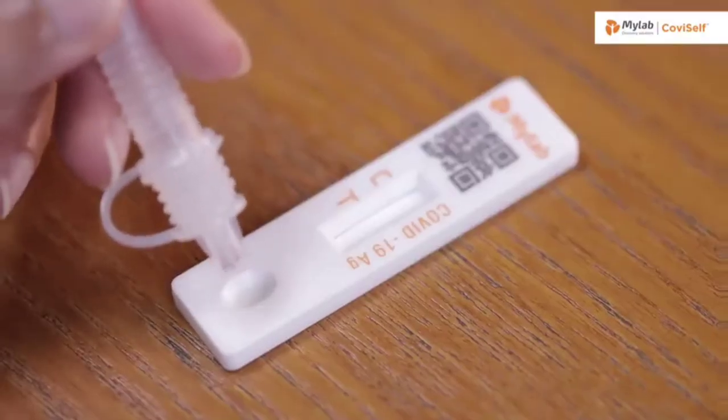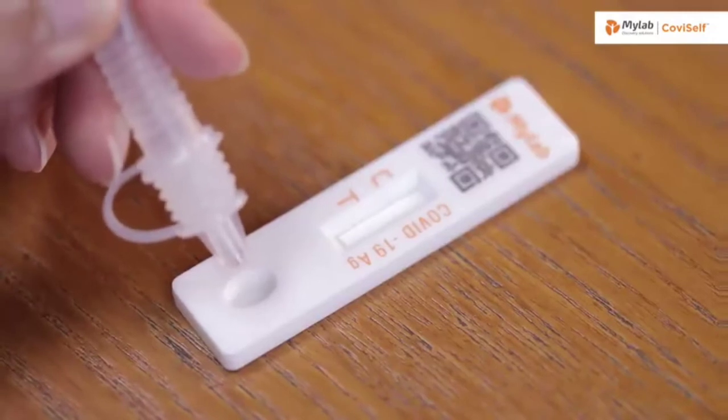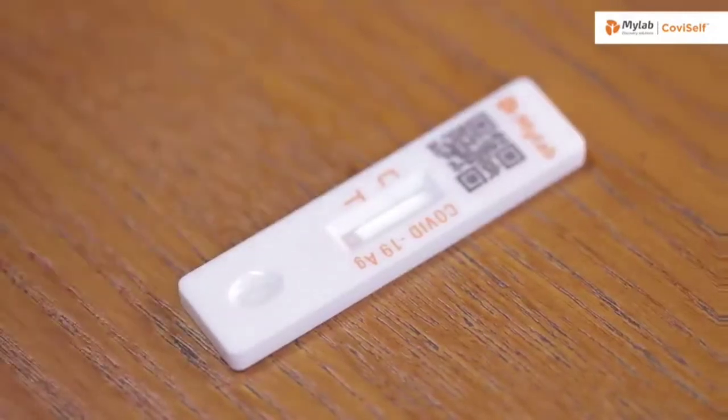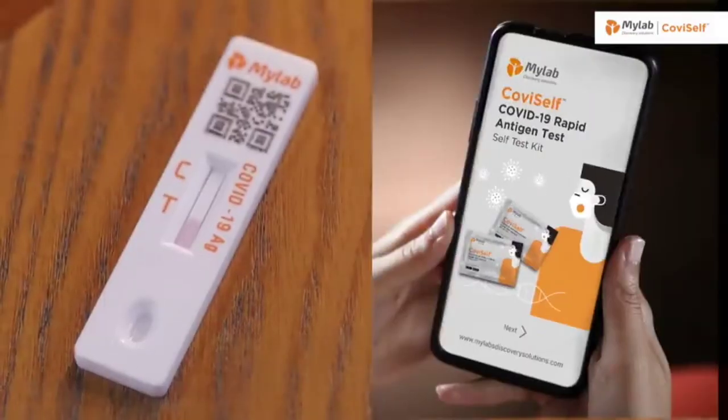Take the test card and add two full drops into the well by pressing the tube. Wait for 15 minutes for the results to appear. Any results appearing after 20 minutes are considered invalid.